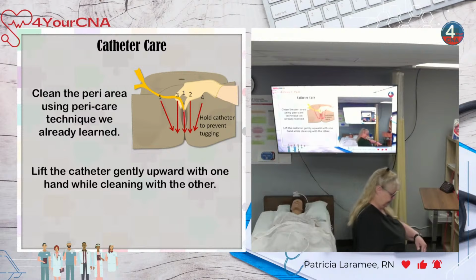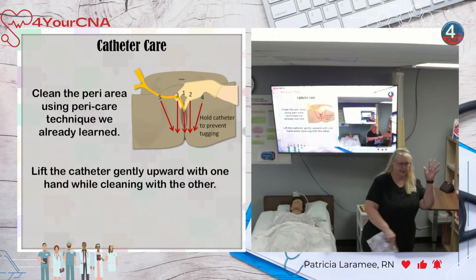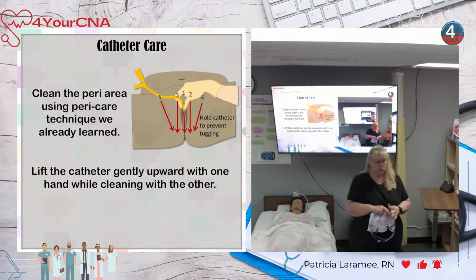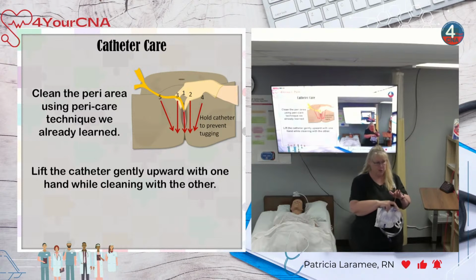Put your hand out like this. Open your fingers a little bit. Okay. I can pull. Because you've got quite a bit of tension there. It's not as easy as plop, right? So what we want to do is try, but that stretch is going to hurt. I mean, there are still some nerve endings there. They're still going to feel it if we pull too hard.